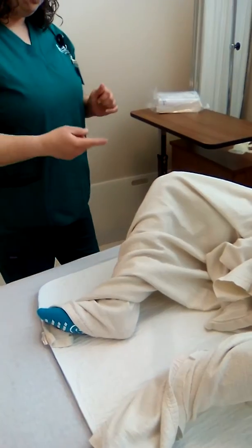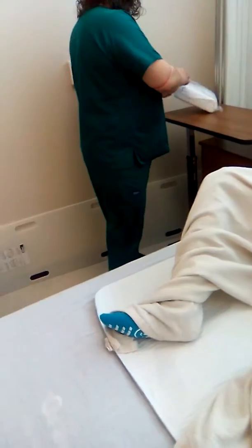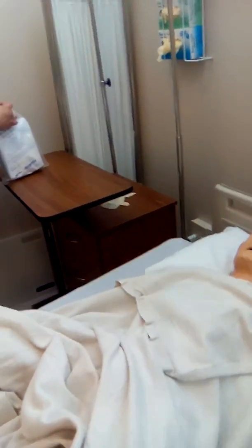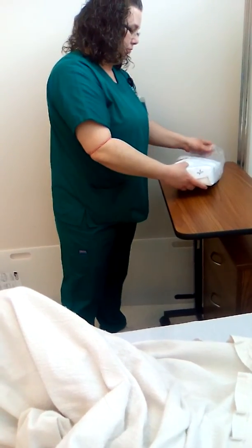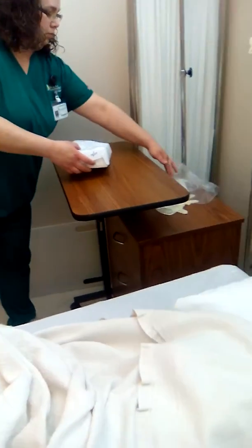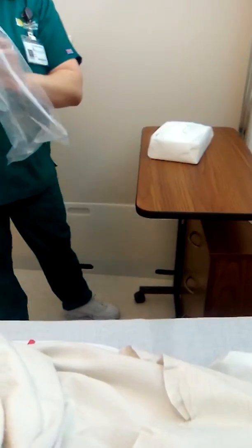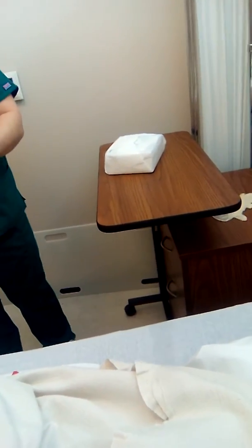I will open my kit. I am actually going to use this as my trash at the end of that.